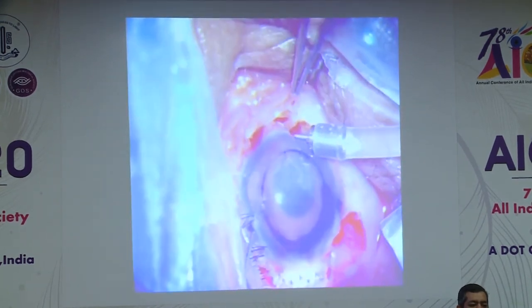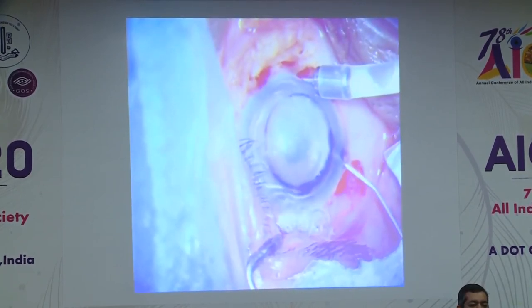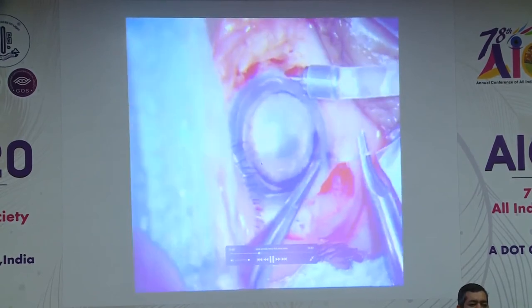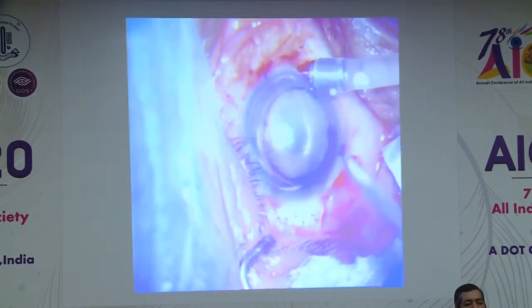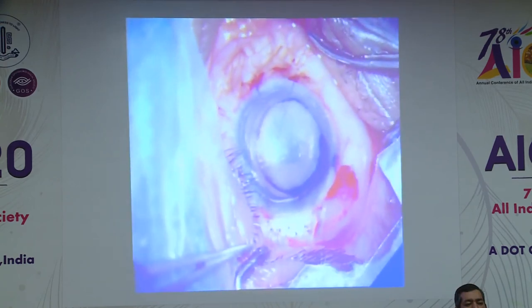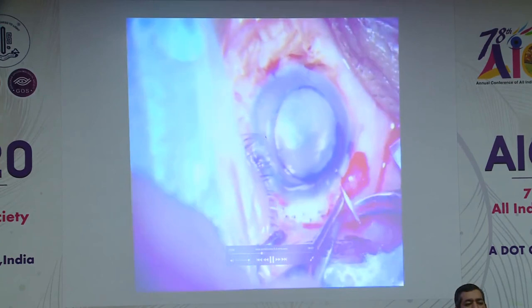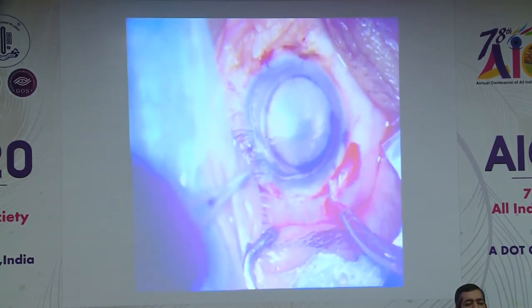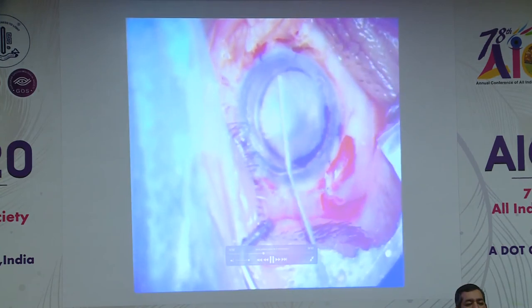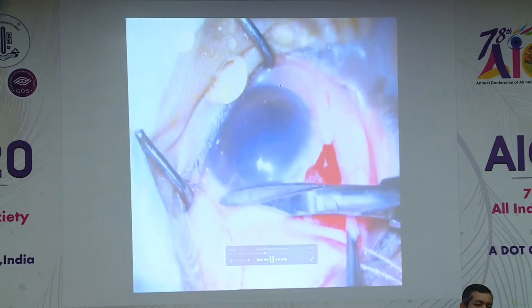with the sutures. I close my tunnel, and I use C3F8 gas in this because there was no iris diaphragm. C3F8 in non-expansile concentration, and I definitely suture all my side ports because I want no leakage. This keeps me secure. I remove it the next day, and after that I iron it out so as to remove the interface fluid, if at all.